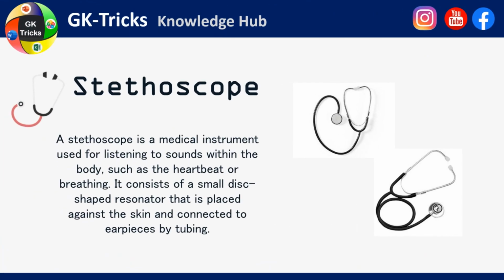Stethoscope. A stethoscope is a medical instrument used for listening to sounds within the body, such as the heartbeat or breathing. It consists of a small disc-shaped resonator that is placed against the skin and connected to earpieces by tubing.